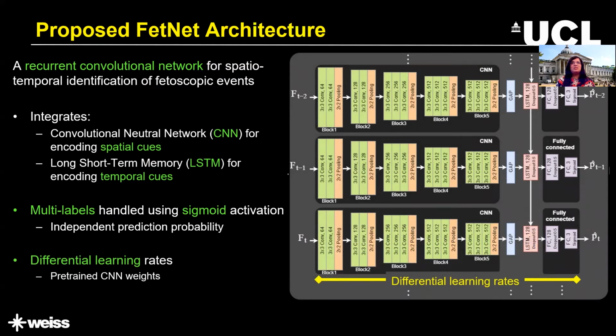Pre-trained weights for VGG16 networks are available, but the later layers are initialized randomly and need significant update compared to earlier layers. Therefore, we use differential learning, which implies that a smaller learning rate was assigned to the earlier layers and a relatively larger learning rate was assigned to the later ones.